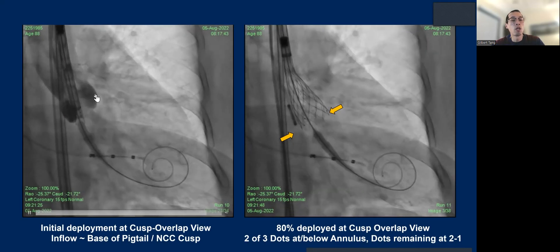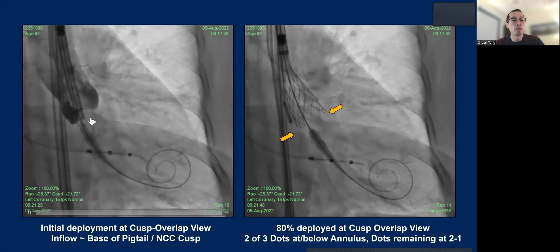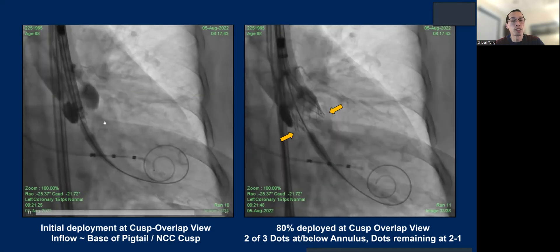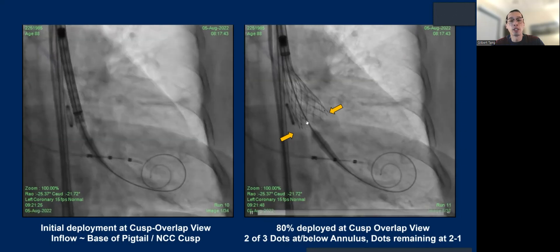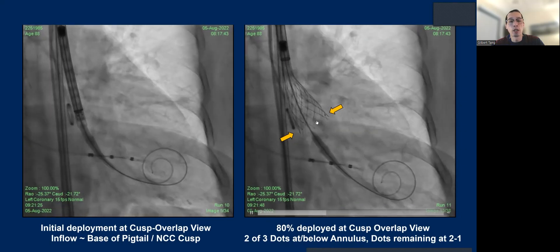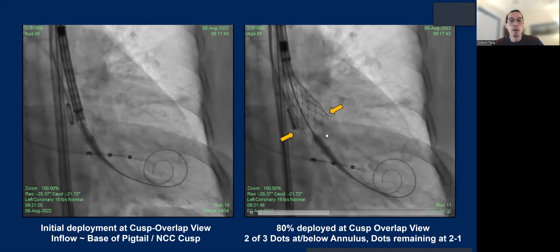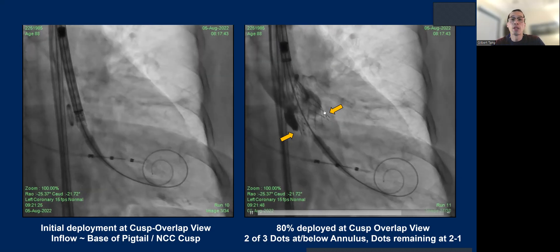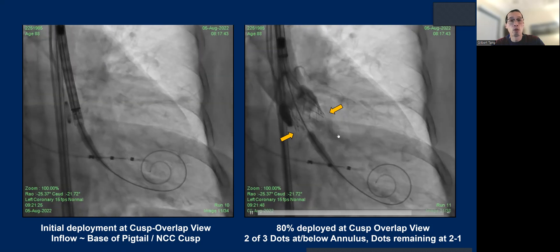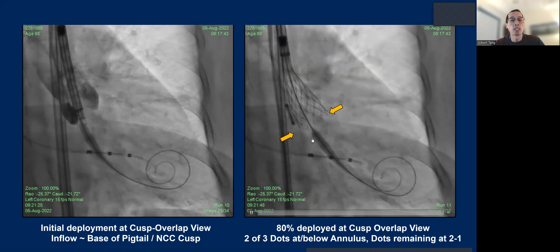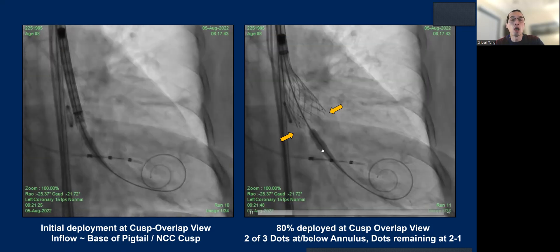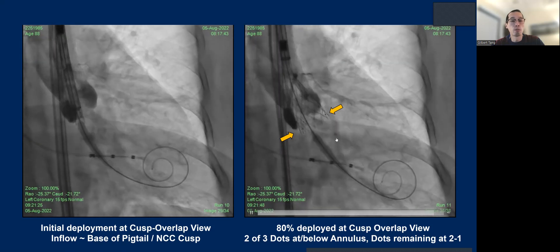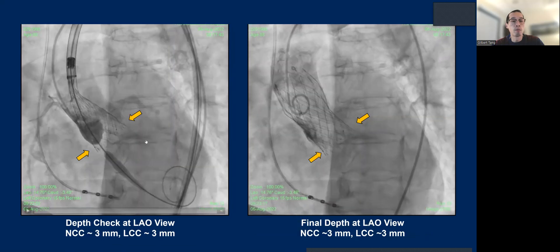On the cusp-overlap view, we line up the inflow of the Evolut FX with the pigtail at inflow-to-inflow, such that when the valve starts to flower, the dots will land right at the annulus. What we're aiming for is two or three dots at or just slightly below the annulus. If two or three dots are above the annulus, you're too aortic and will need to recapture to avoid a pop-up. With the FX system, the valve dives minimally, so you just need to make sure the dots are not placed too high.